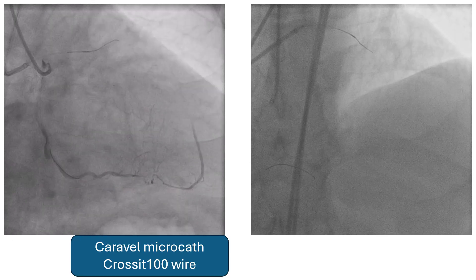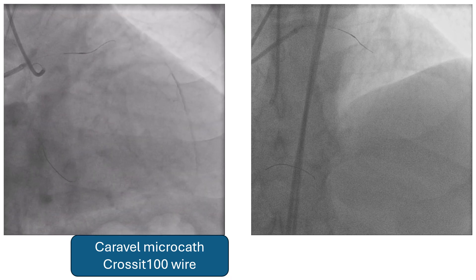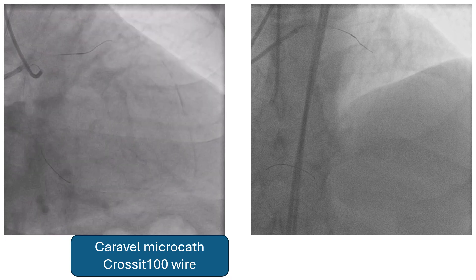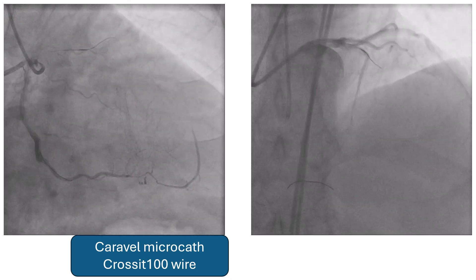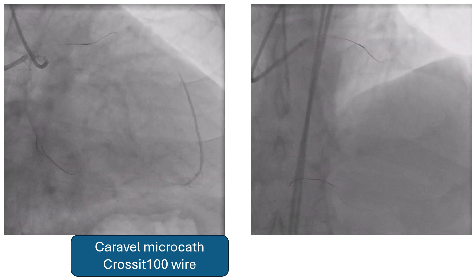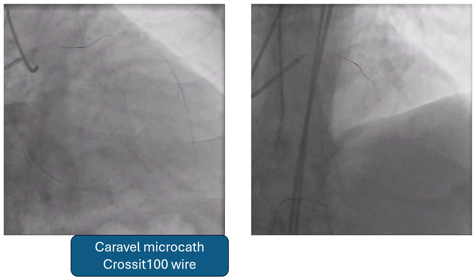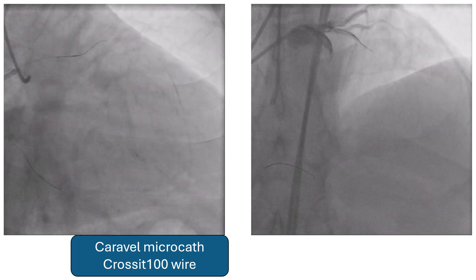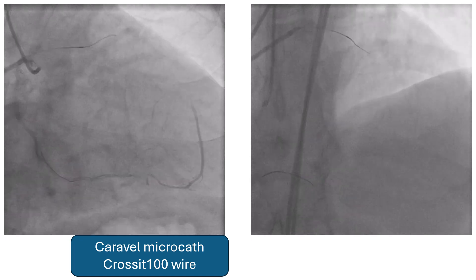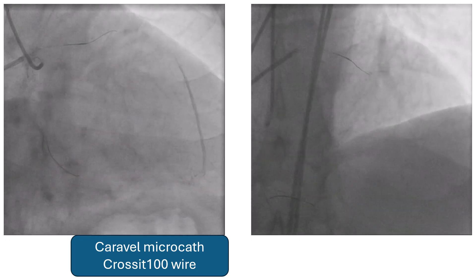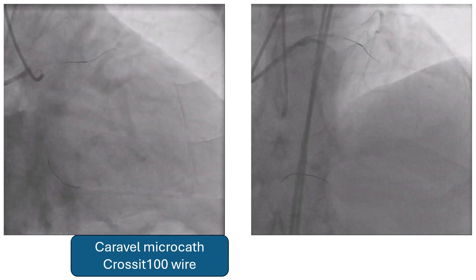We started with a Caravel microcatheter and a Cross 100 wire. This maneuver revealed another characteristic of the CTO, which is some tortuosity inside the lesion. It was difficult to cross the distal cap with the Cross 100.